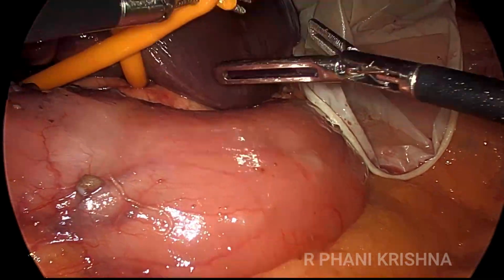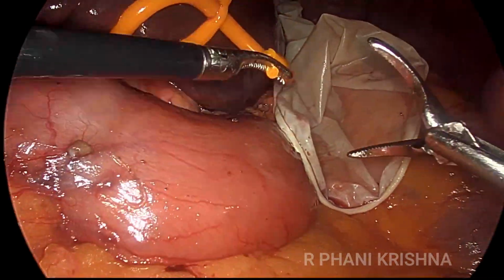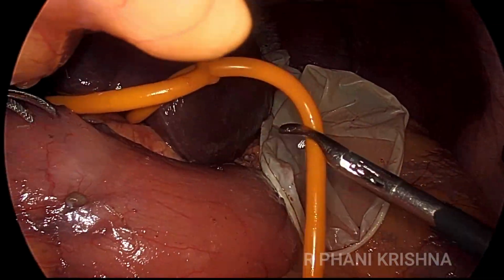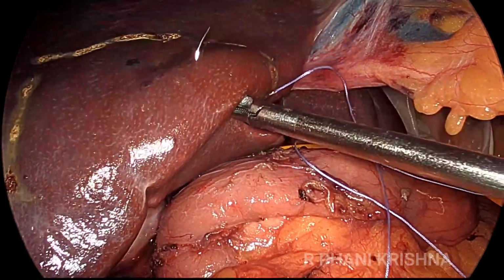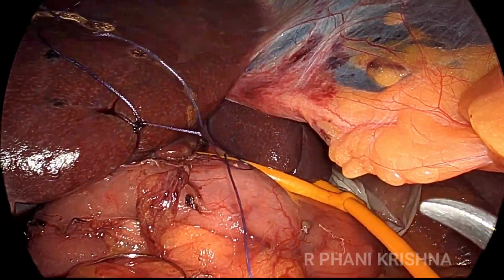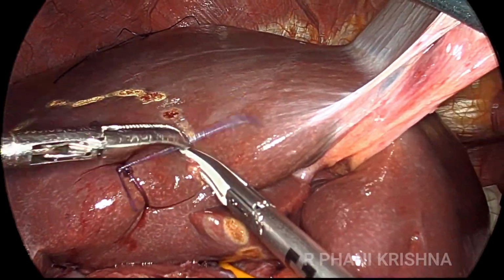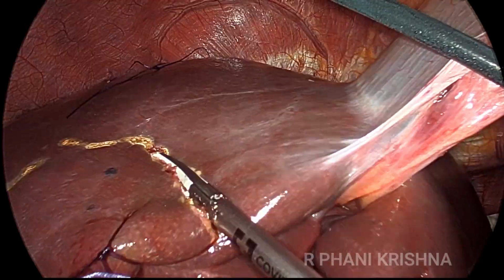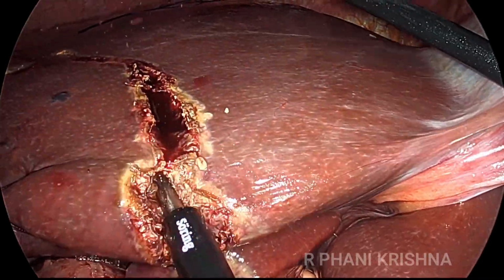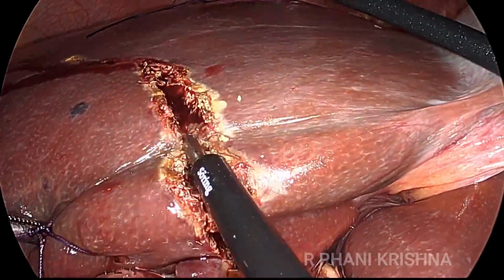Subsequently, a Foley's is placed at the hepatoduodenal ligament in this way to use for an intermittent Pringle if needed during the parenchymal transection. A stitch is taken on the liver parenchyma for retraction. Majority of the dissection will be done from the medial side, that is the segment 4 side. Initial incision is made with diathermy and ligature.